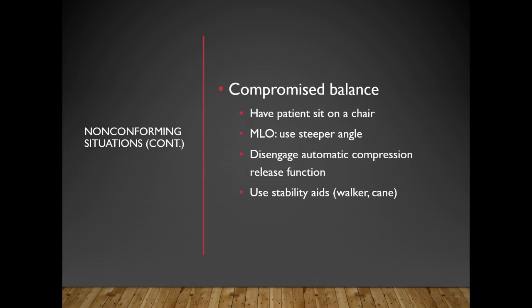And the other thing is, in most units, they default to where the minute the exposure ends, that compression releases automatically. You want to disengage that and you want to wait for you to come and disengage it, because sometimes when a patient is in compression and that thing disengages, they can lose their balance if they're very unsteady.